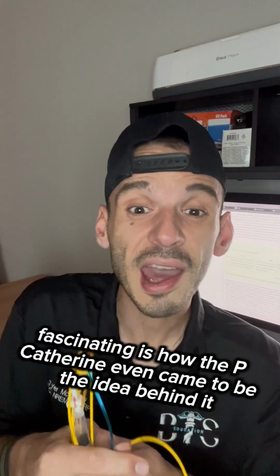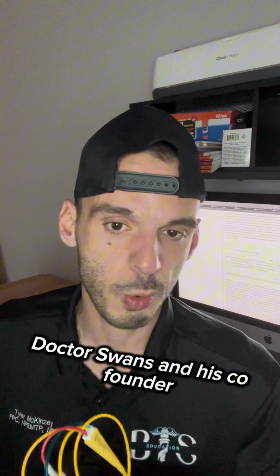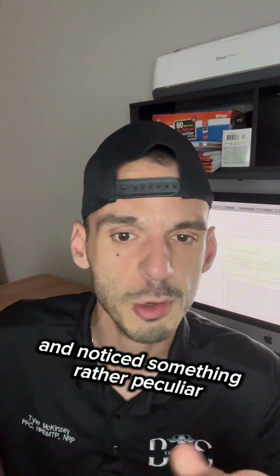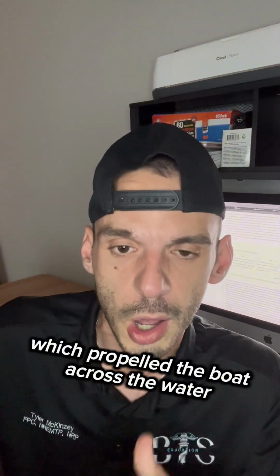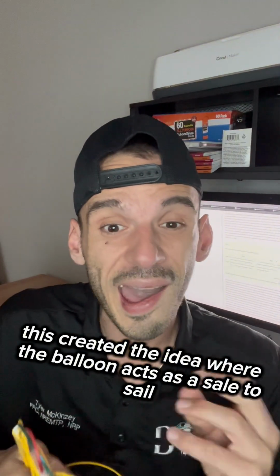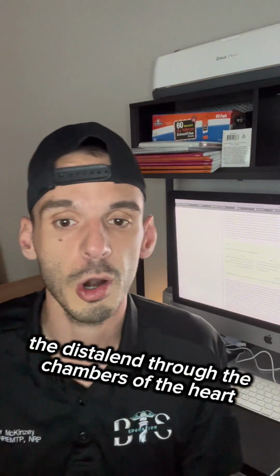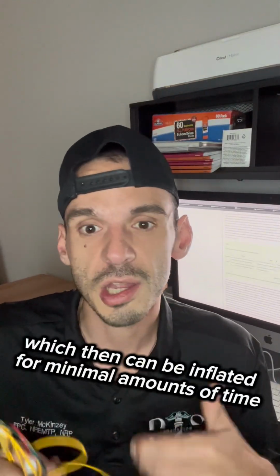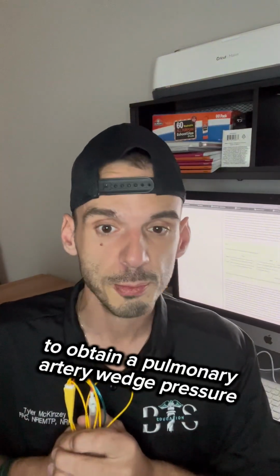Fascinating is how the PA catheter even came to be, the idea behind it, because it's rather fascinating. Dr. Swan and his co-founder were observing sailboats off the beaches of Santa Monica and noticed something rather peculiar: how the wind influenced the sail, which propelled the boat across the water. This created the idea where the balloon acts as a sail to sail the distal end through the chambers of the heart with minimal irritation to the endocardium, allowing it to seat in the pulmonary artery, which then can be inflated for minimal amounts of time to obtain a pulmonary artery wedge pressure.